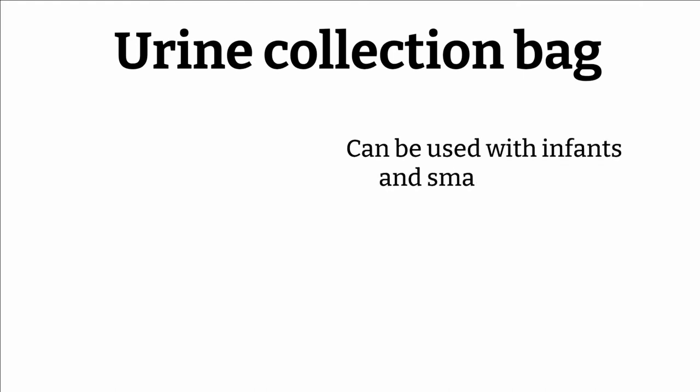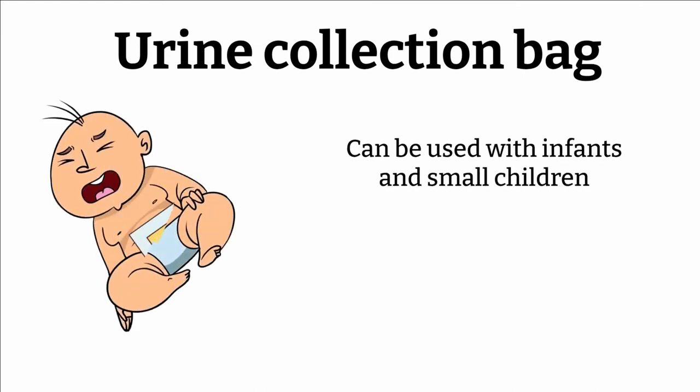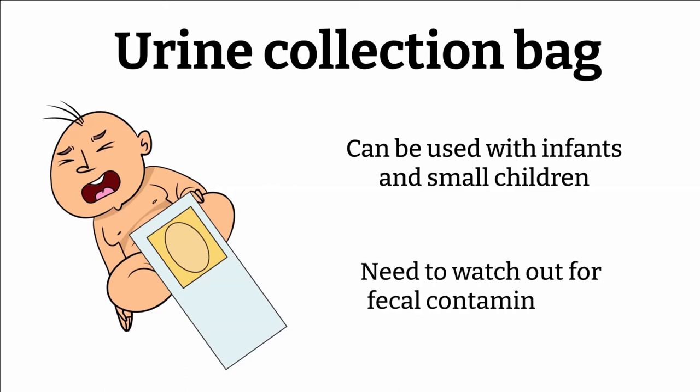Urine collection bag. This method is used to obtain urine from infants and small children. A pediatric urine collection bag is attached to the patient's genitalia. The bags are soft and pliable and cause little discomfort to the patient. However, one thing to be watched out for with this method is fecal contamination.